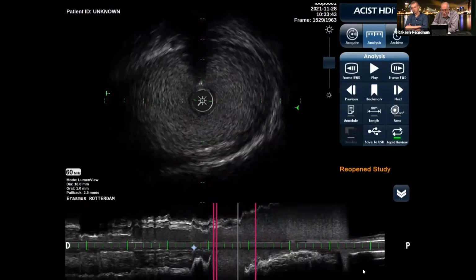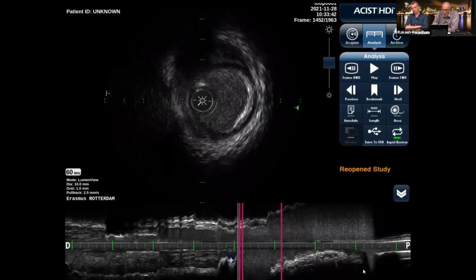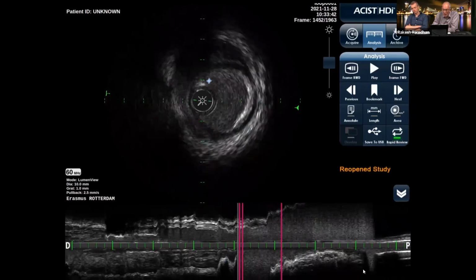And then I got a bit suspicious, and you see we have two wires in there, that makes it a bit difficult. So what happened? Did we make a dissection that it was iatrogenic? I was not sure about this region there. The two wires didn't help.